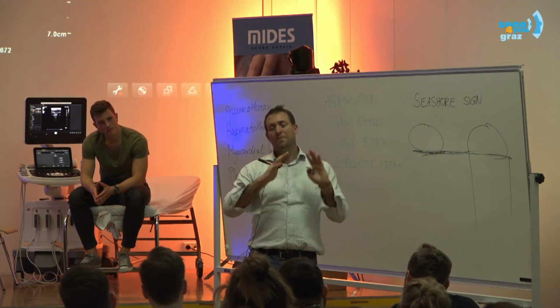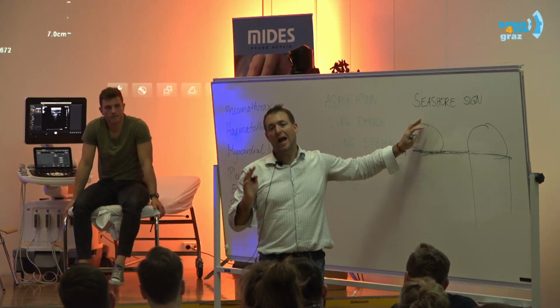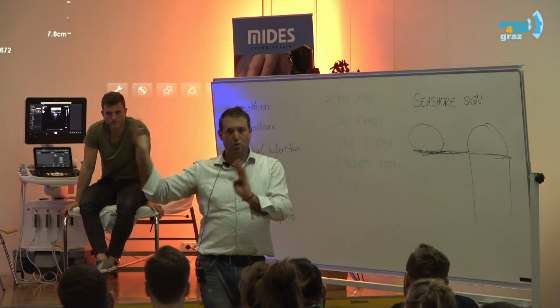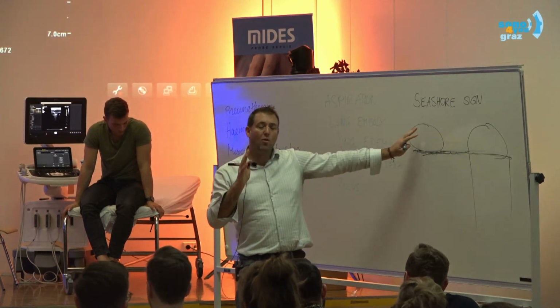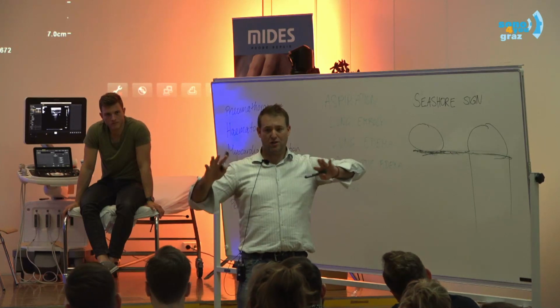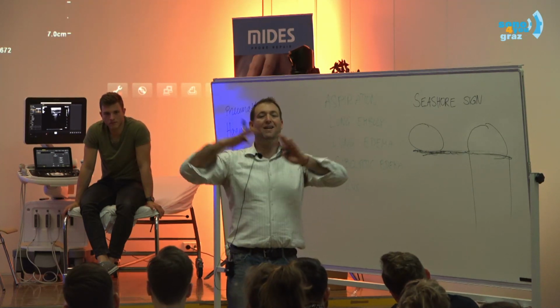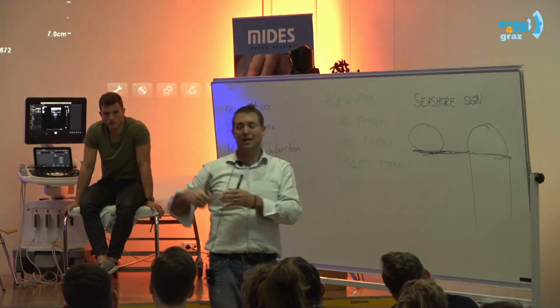Because people assume that something is round and black, that would be a rib, they can make mistakes. So I want you to be very cognizant that not every black is fluid, not every white is pleura, and so forth, okay? Just to show you how radiologists, who are the ultimate masters of the details, are also taught and how they think.